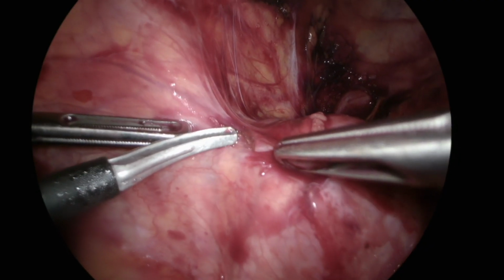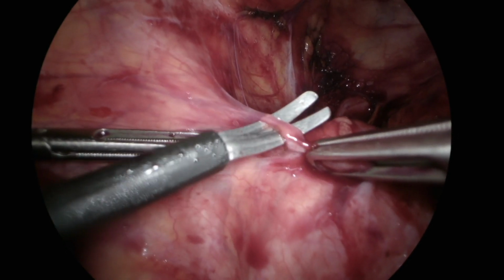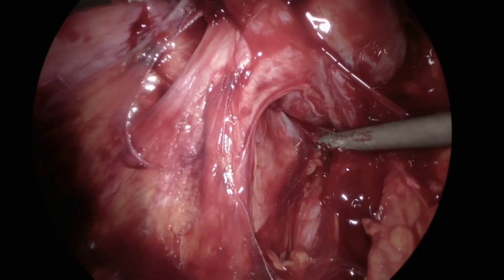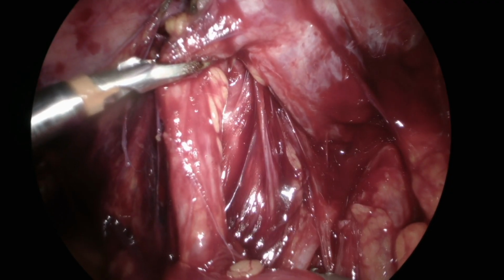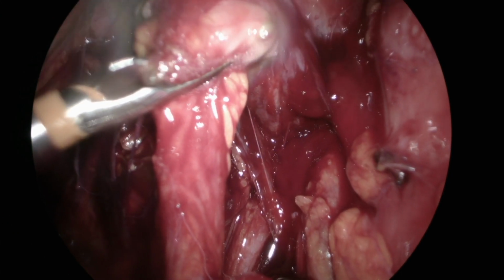We then began to skeletonize the infundibulopelvic ligament with a combination of sharp and blunt dissection. We began superiorly and then worked our way down its medial and lateral aspects. Throughout this dissection, we ensured that we were well away from the ureter. With the infundibulopelvic ligament free from its attachments and critical structures, it was sealed with electrosurgery and transected.